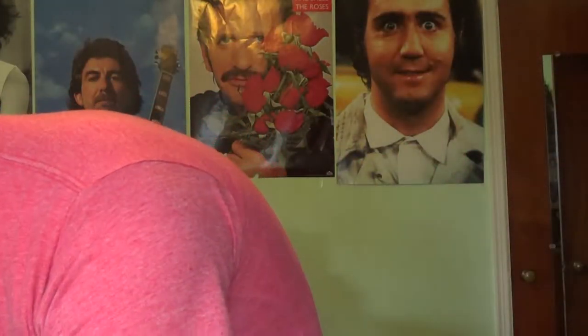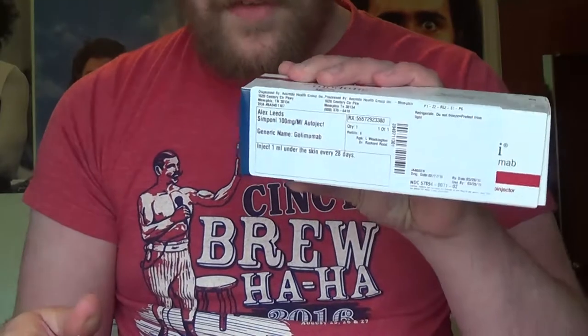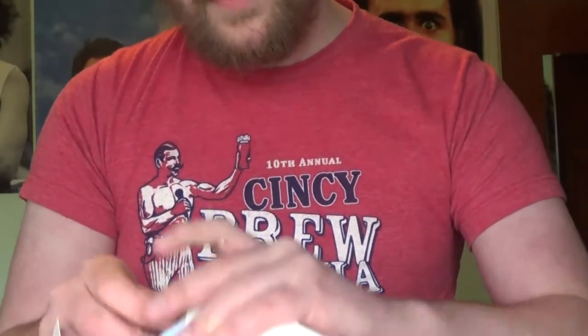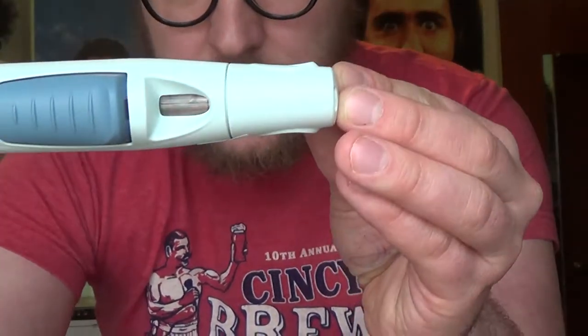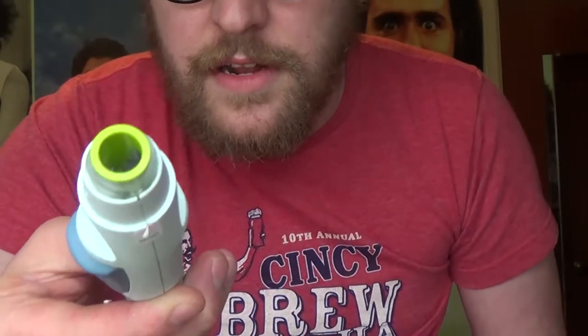I already know the instructions so I don't have to get that out. It comes in this kind of package right here with my name and everything on there. You're supposed to take it out — check out this bad boy. There's a little window where you can see the medication in there; you're supposed to check it to make sure it's clear, and it's clear. There's a giant bubble in there, and then you pop this off — there's a little needle in there.